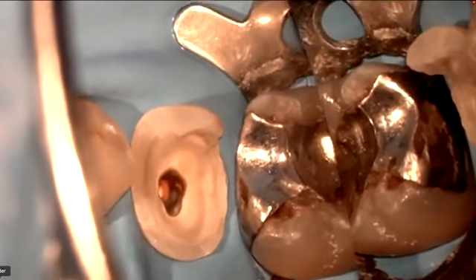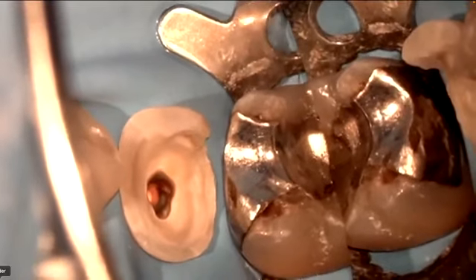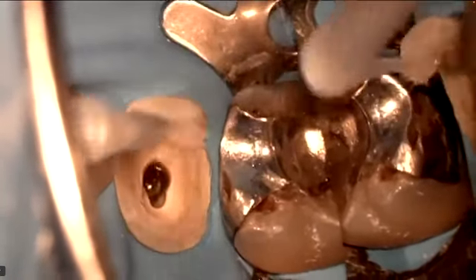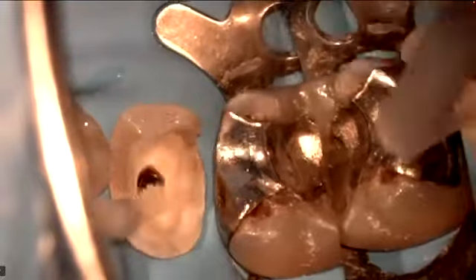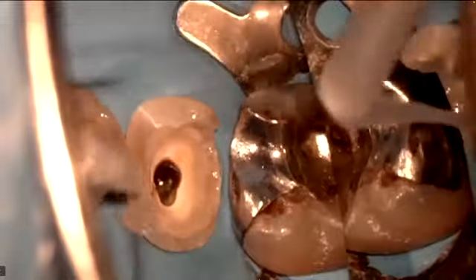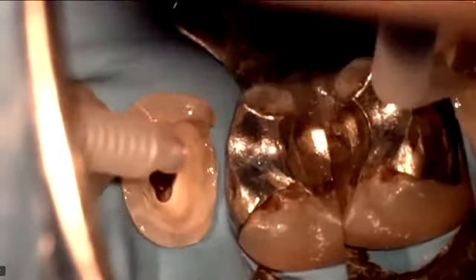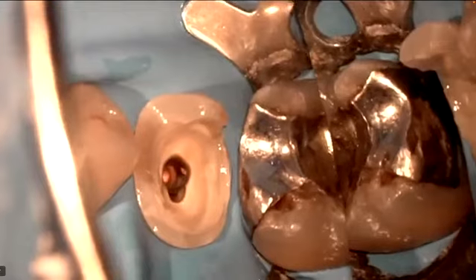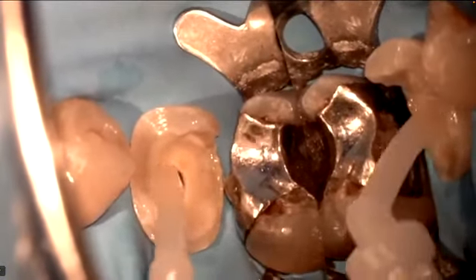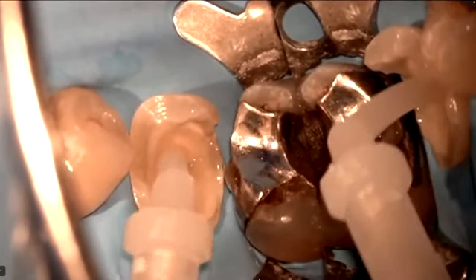This is the tooth after the application of primer. And then I'm applying the bonding. I'm using the same technique, so active brushing with a very small brush in order to be able to reach all of the parts of the tooth. Sometimes I also use a different micro brush which is specifically designed for the application of adhesive into the root canal because it's thinner and longer and it helps to reach the deepest zones of the post space.